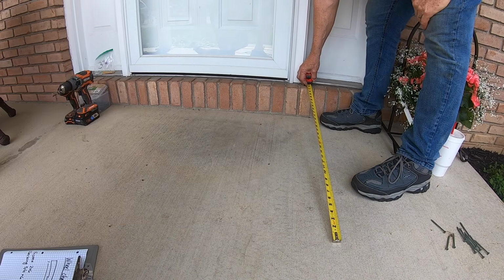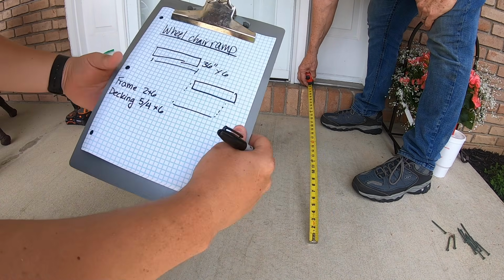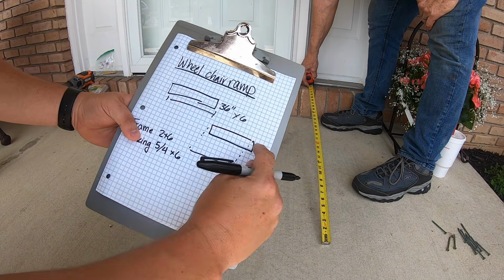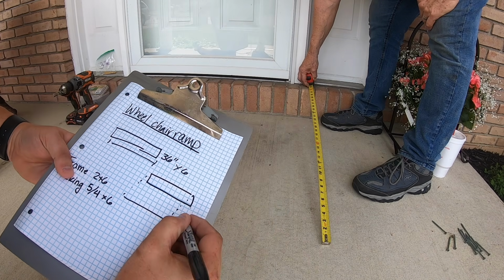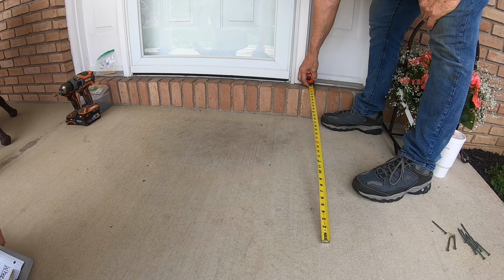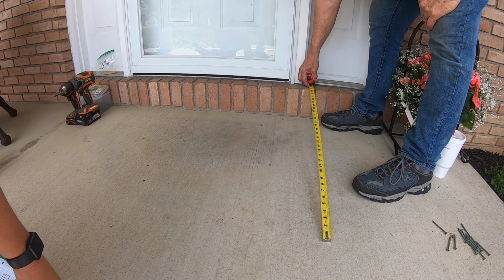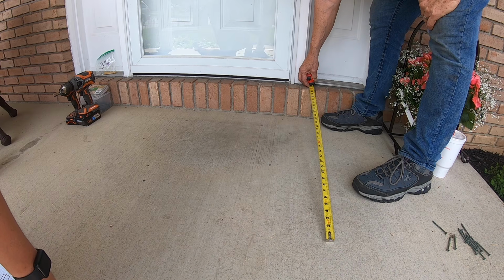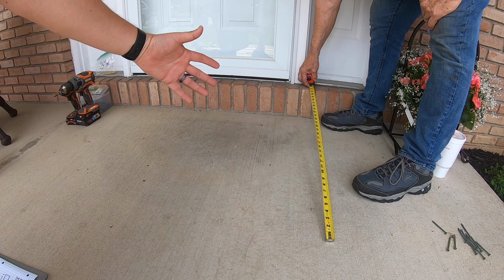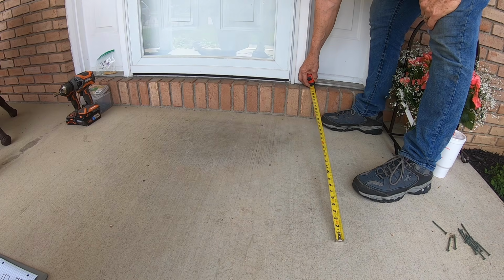We've determined the run at 32 inches. So what you're looking at is you have the frame there and the run down will be 32 inches. The reason we chose that is it's a good slope to allow that wheelchair to go up and down easily. This is obviously not ADA approved, but this is for somebody who needs a short-term wheelchair ramp that is not going to be bolted. We eventually do want to be able to sell the house. And so nothing is being bolted down. This is a floating wheelchair ramp.